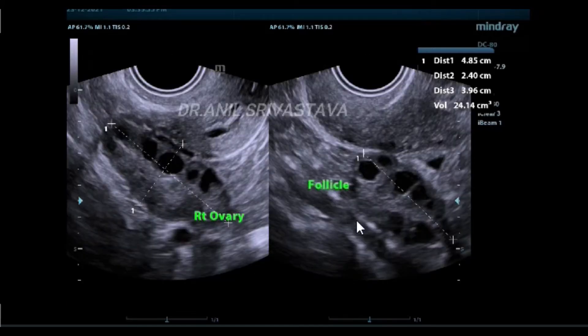This is the right ovary having numerous follicles. A large number of follicles are attached on the periphery with increased stromal content.